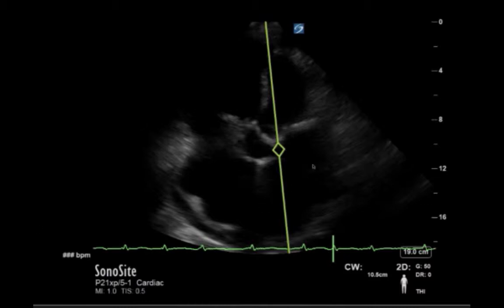And for stroke volume determination, as we'll talk about in a subsequent screencast, you want to place a pulse wave Doppler gate in the left ventricular outflow tract. So in order to engage the Doppler mode, the spectral Doppler mode, the user presses the Doppler key, not the color key now, but the Doppler key. And many of you have probably accidentally done this at times and brought up the pulse or continuous wave sampling lines and not known entirely what to do with them. But now you will. So here the person pressed Doppler.